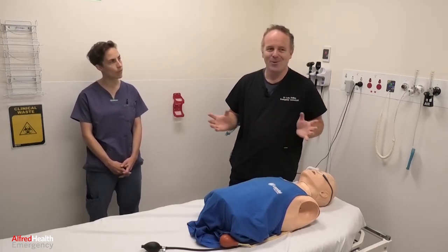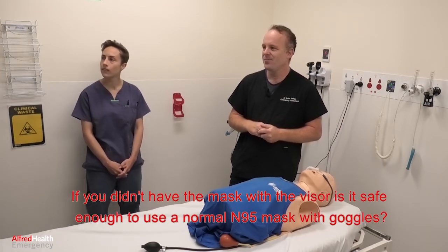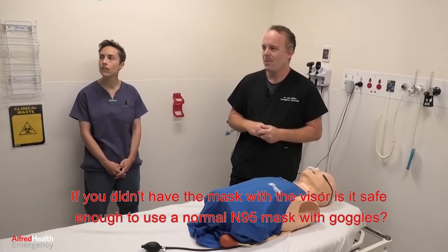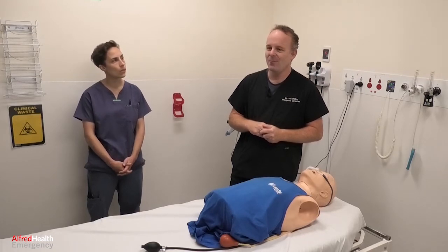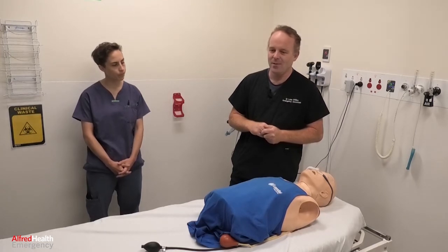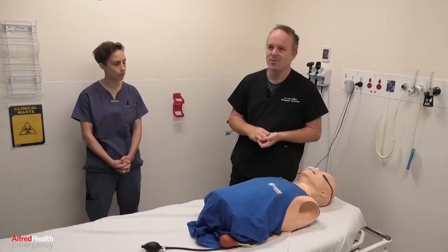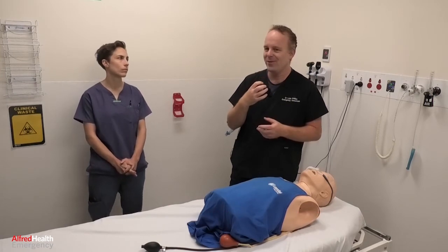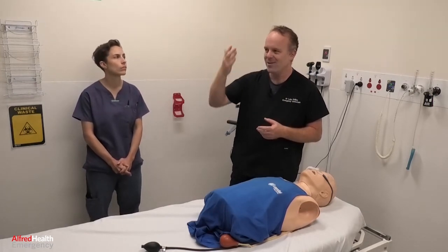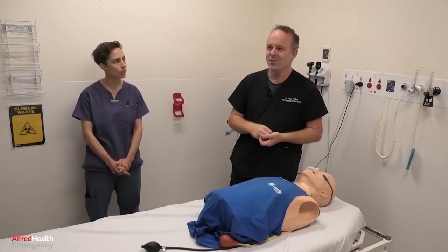Any questions so far? There's a lot of people in the room. If you didn't have the mask with the visor, is it safe enough to use a normal N95 mask with goggles? I personally wouldn't. We can get those from theatre, we can get them from ICU, and we're looking into getting visors that come down over your face as well. Would you still need an N95 mask? N95 mask always. I would always put on an N95 mask and a surgical mask with a visor, because I feel the filtration is probably better with the N95 than the surgical mask, as long as you've got a proper fit.